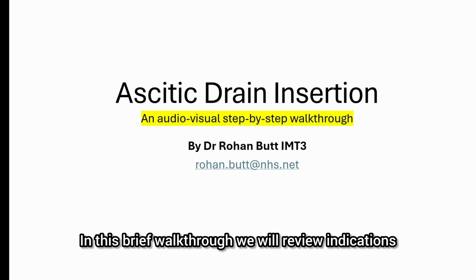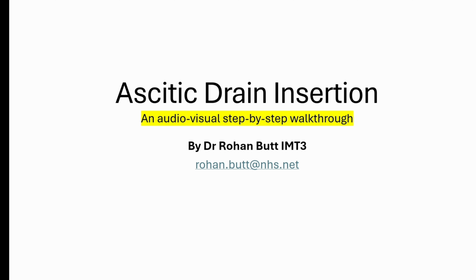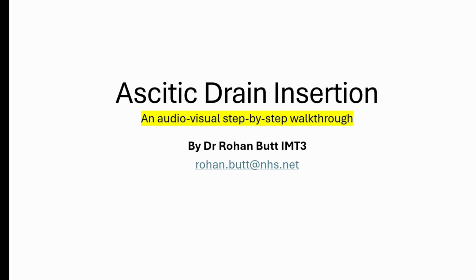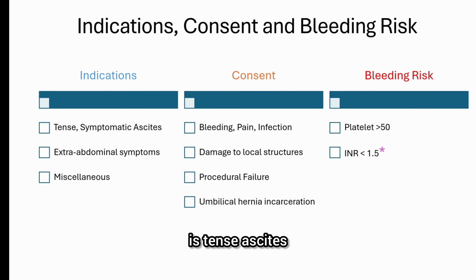In this brief walkthrough, we will review indications, consent, and the procedural steps in successfully and confidently performing this bedside procedure. So let's begin. The main indication for therapeutic paracentesis is tense ascites.